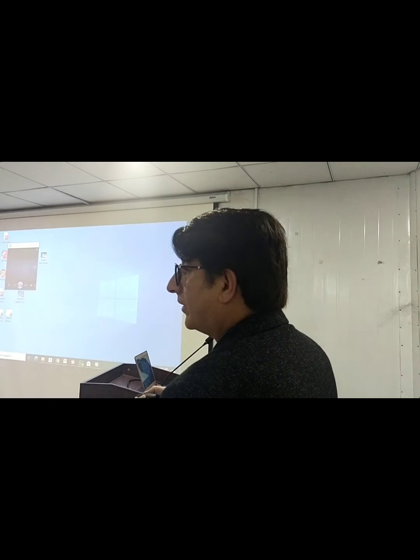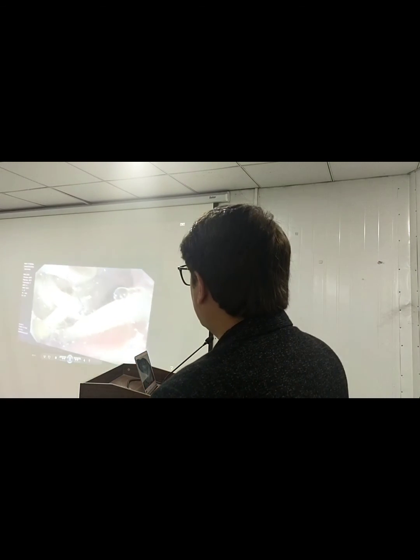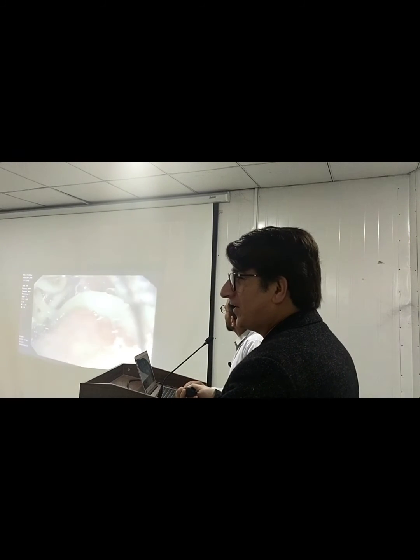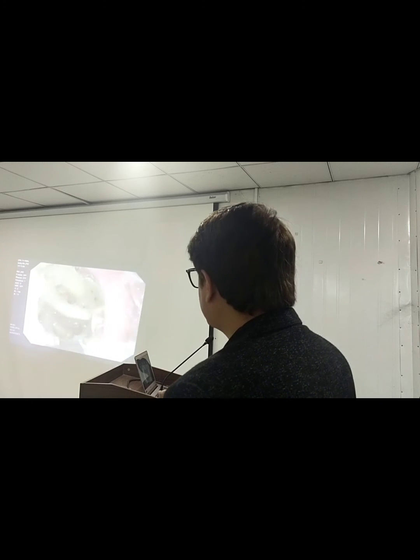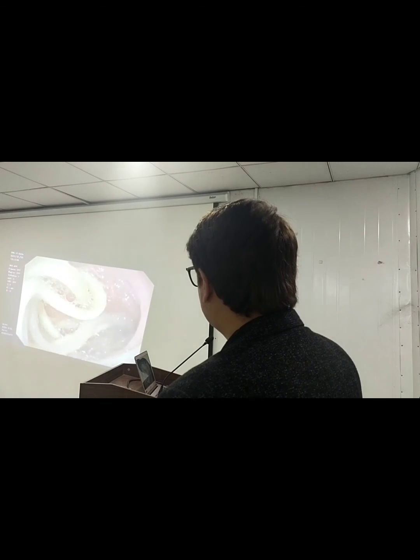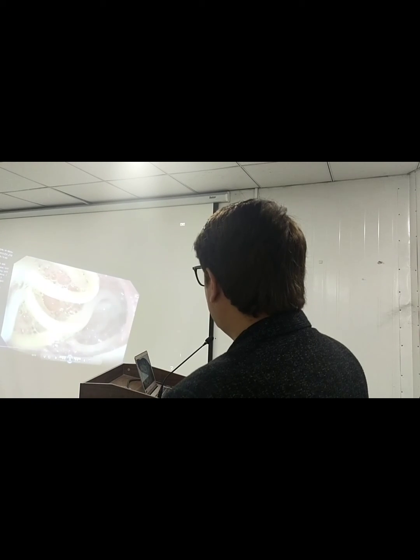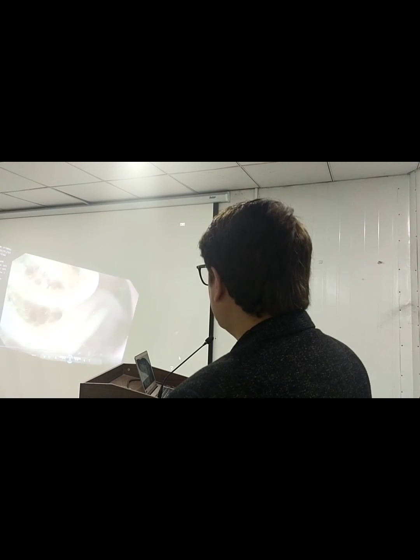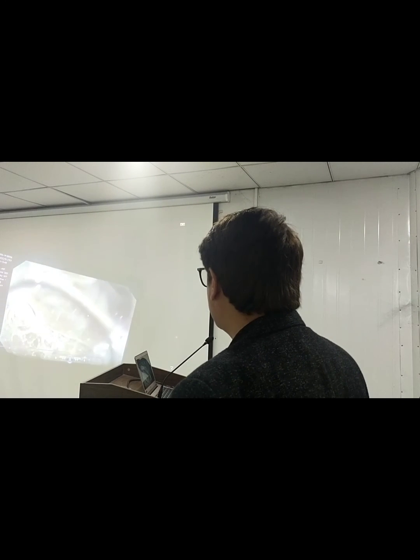Hopefully all those who have taken breakfast and those who have not will delay the breakfast for 1 year after seeing this video. These are the worms. You can see a lot of clusters of worms, an army of worms, almost 6-7 worms. This is the duodenum, and the patient had biliary ascariasis. Along with the biliary ascariasis, this female patient had multiple worms in the duodenum.